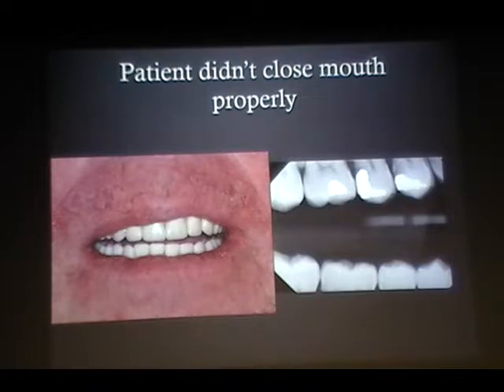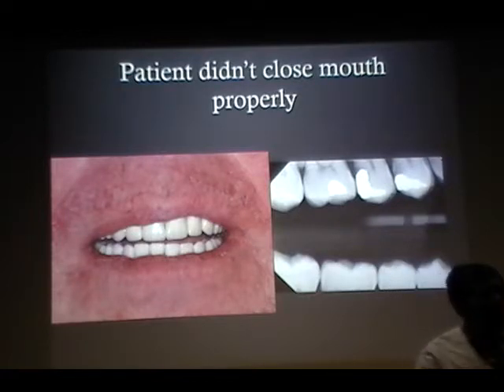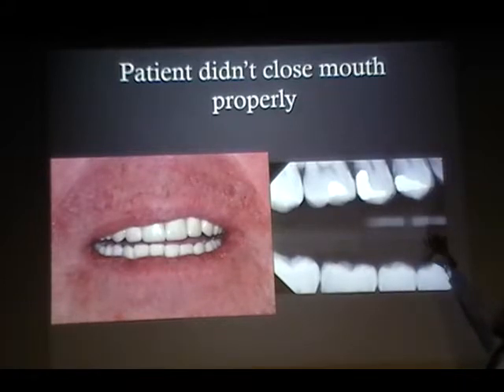If you see here, this is a bitewing radiograph. Again, the patient did not bite properly. When you ask the patient to close their mouth, most of the time they do like this. They will not bite on their teeth like this, you know. So please make sure that they are biting on that bite block. Otherwise, you are going to miss 3 to 4 millimeters, which we are supposed to capture.